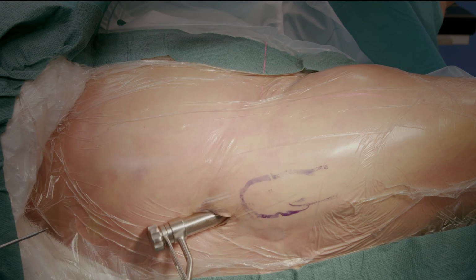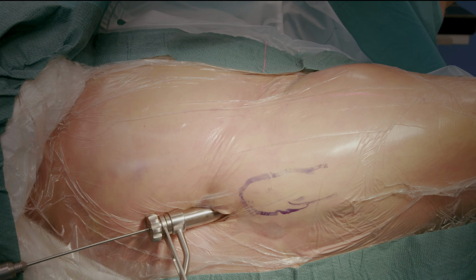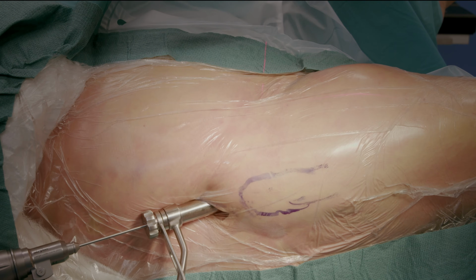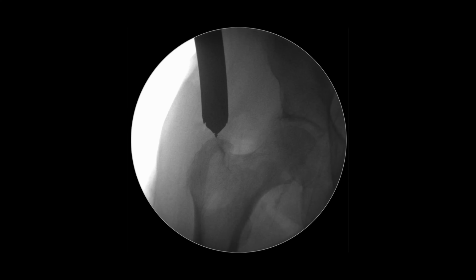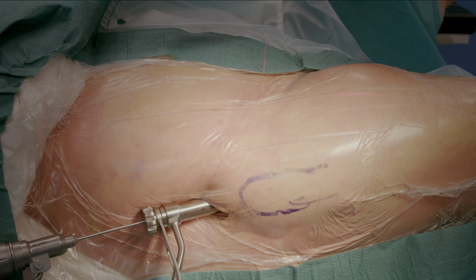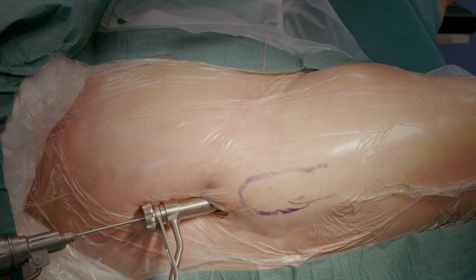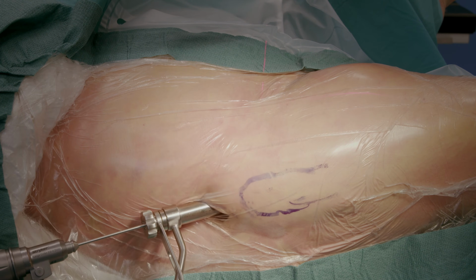Then, put the reamer sleeve with the multi-hole trocar in place and make sure that the guide wire makes contact with the bone. Then, under fluoroscopic control, we find the optimal site for insertion. Now the guide wire is at the tip of the greater trochanter. It is of vital importance that this guide wire comes from a very proximal direction here so that it is parallel as possible with the femoral diaphysis and thus prevents entering too laterally.